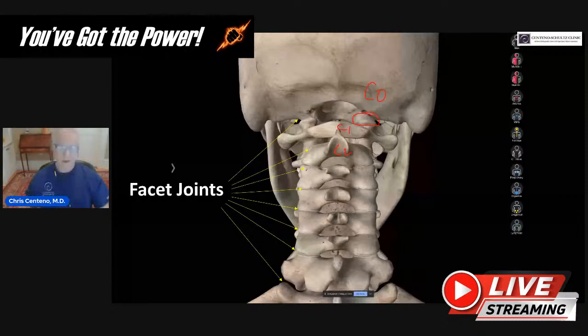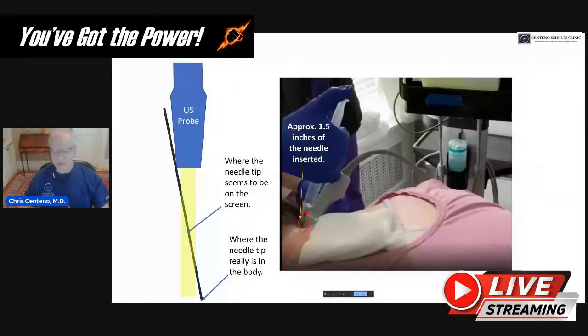We see here that this provider took that very, very big needle, and the vast majority of the needle is now buried in this woman's neck. This woman seems about average weight by looking at the amount of heft around her neck — so that's pretty darn deep right now. As an expert in this area, I can see she's got the probe going one direction and the needle going another direction, so they're not parallel. What's happening is she's seeing the needle somewhere in here, thinking that's the tip — when in fact, the tip is way down here, out of her imaging plane.